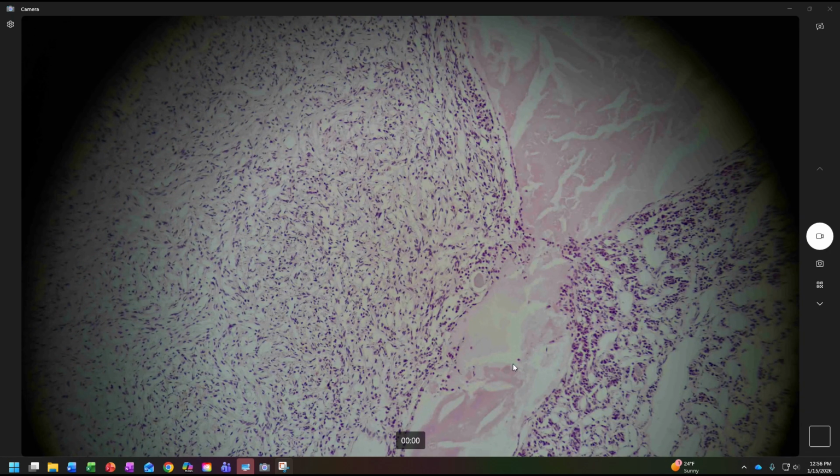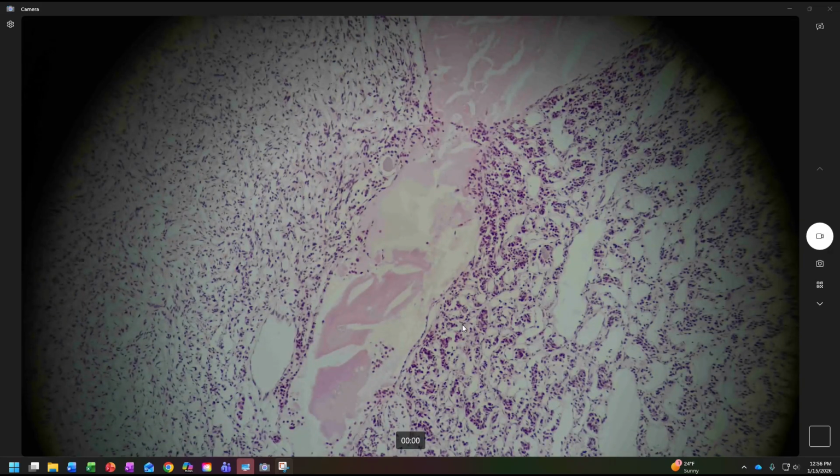And now let's go back and forth. So again, here's our kind of dividing line. And I hope you can see it's a little more wispy, not as packed together. We do have some of these big spaces. Again, I'm not quite sure what these big spaces are. This is a human pituitary gland, so I can't imagine they're fatty deposits. Maybe they are, I don't know.